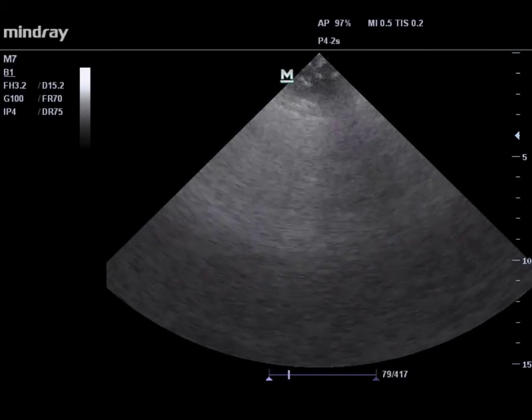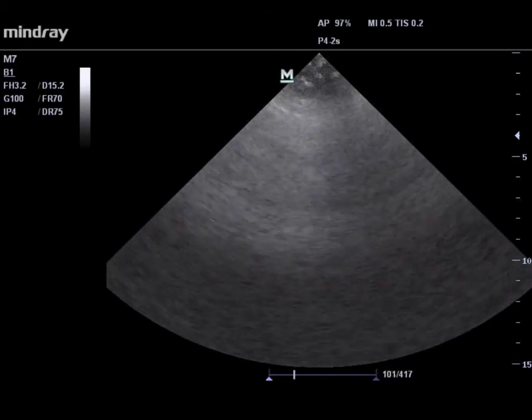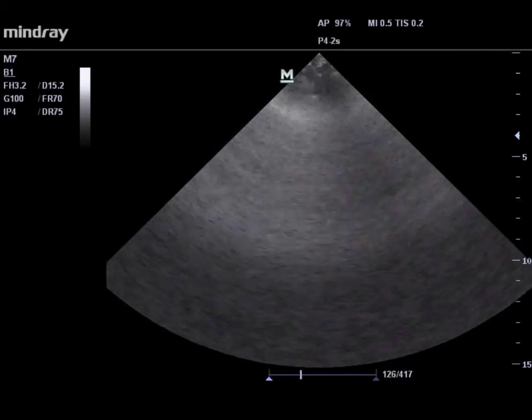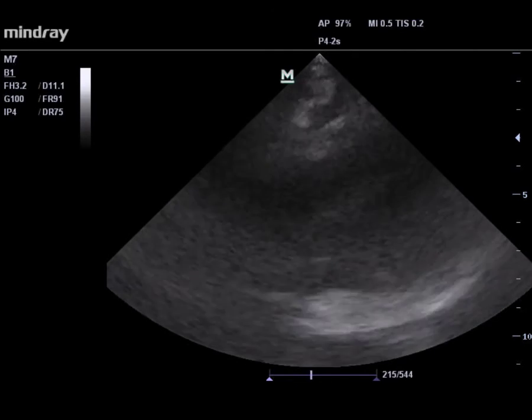But sometimes the images that we get with point of care transthoracic echo are really not that great. Sometimes they're like this one during the pulse checks. I'm sure you've had the case. In cases like that, many times the view and the information we're getting is just simply inadequate for proper decision making. So in those cases, we're left with a black box.